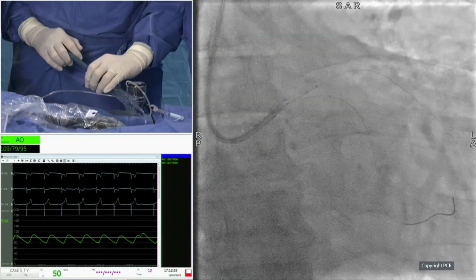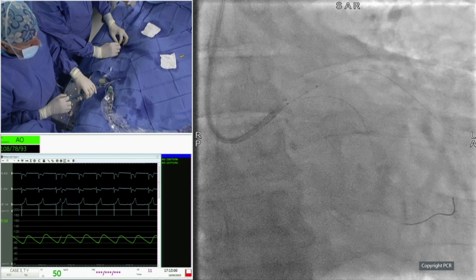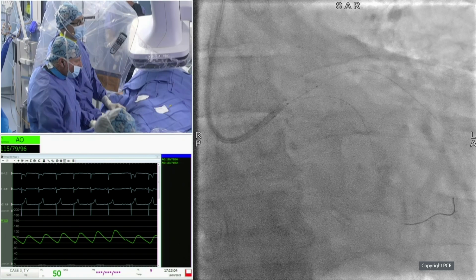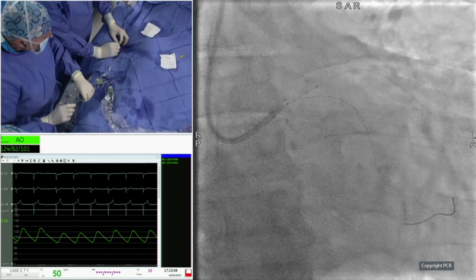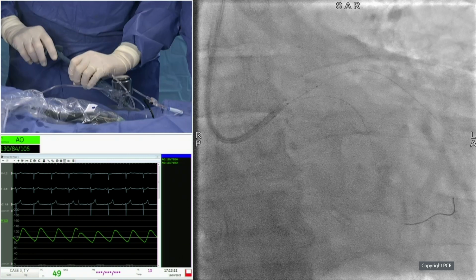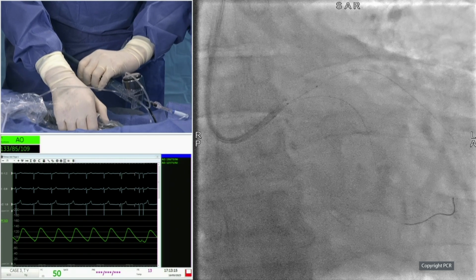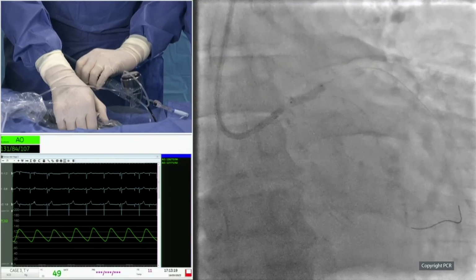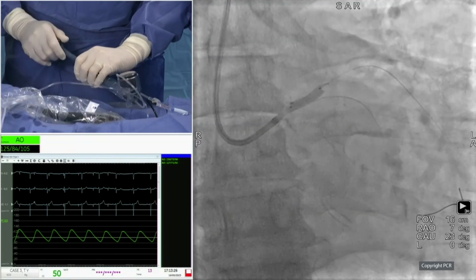It seems that there is a filling defect very close to the ostium of the L circumflex on the angio that you show. Can you tell us? Defect, during the shockwave balloon, you mean? No, before, on the angiography that you show. Particularly, I think it was in the spider view. Probably. A kind of defect there. You can see that was not on the diagnostic angio initially. It was surprising. A new component. I mean, we have to pay attention to that.